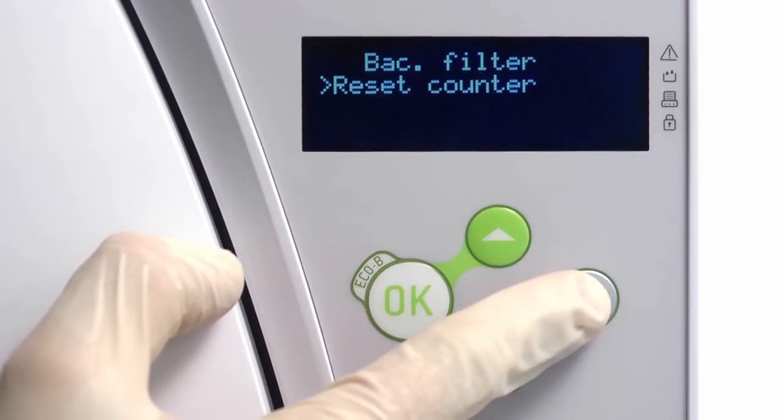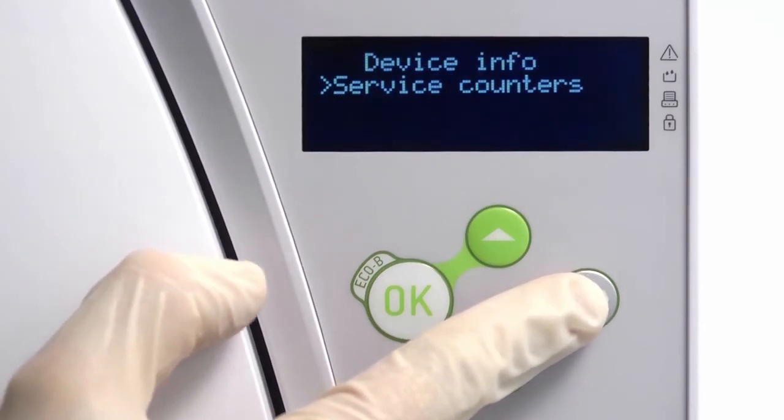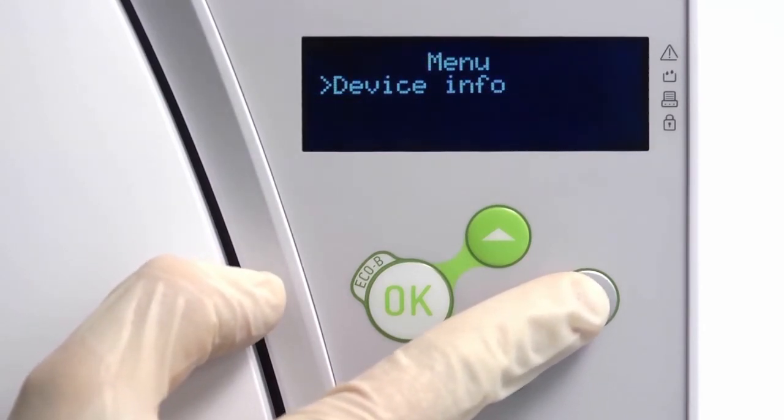Now navigate back to the cycle selection screen to return your Liener steriliser ready for normal operation.